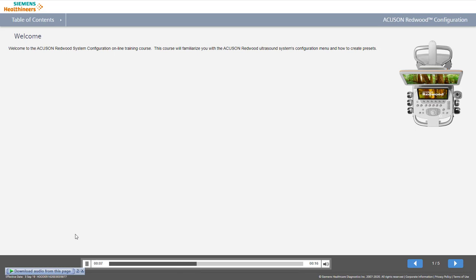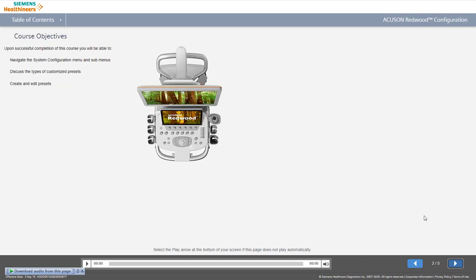This course will familiarize you with the Accuson Redwood Ultrasound System's configuration menu and how to create presets. Upon successful completion of this course, you will be able to navigate the system configuration menu and submenus, discuss the types of customized presets, and create and edit presets.